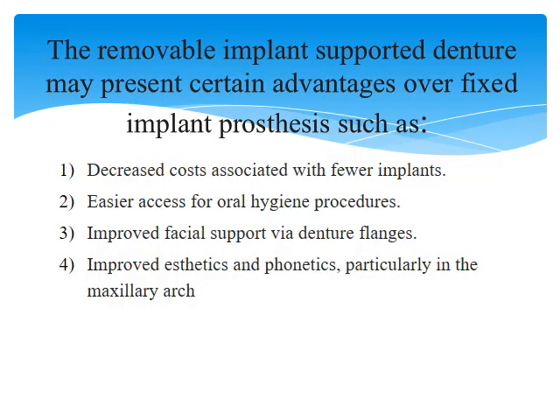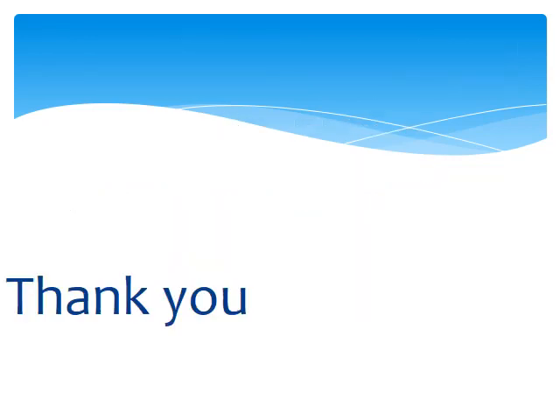The removable implant-supported denture may present certain advantages over fixed implant prostheses, such as decreased cost associated with fewer implants, easier access for oral hygiene procedures, improved facial support via denture flanges, and improved aesthetics and phonetics, particularly in the maxilla.